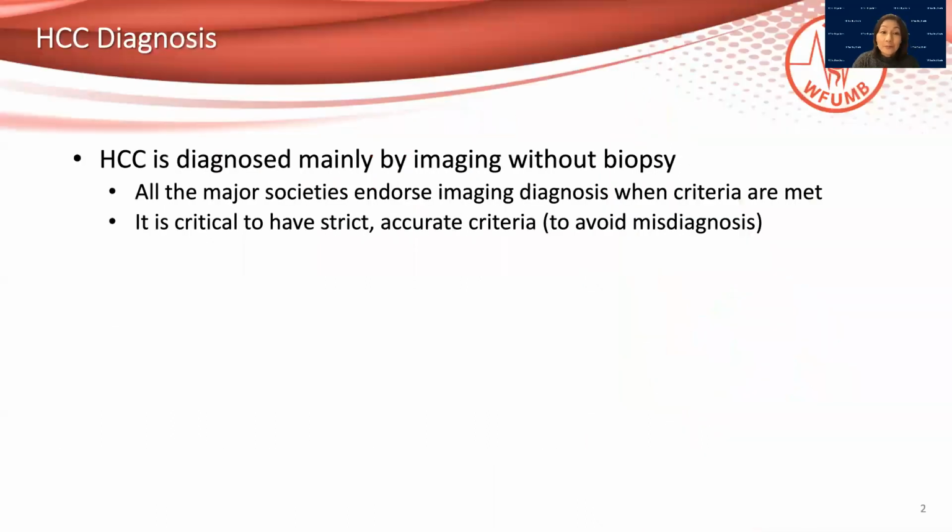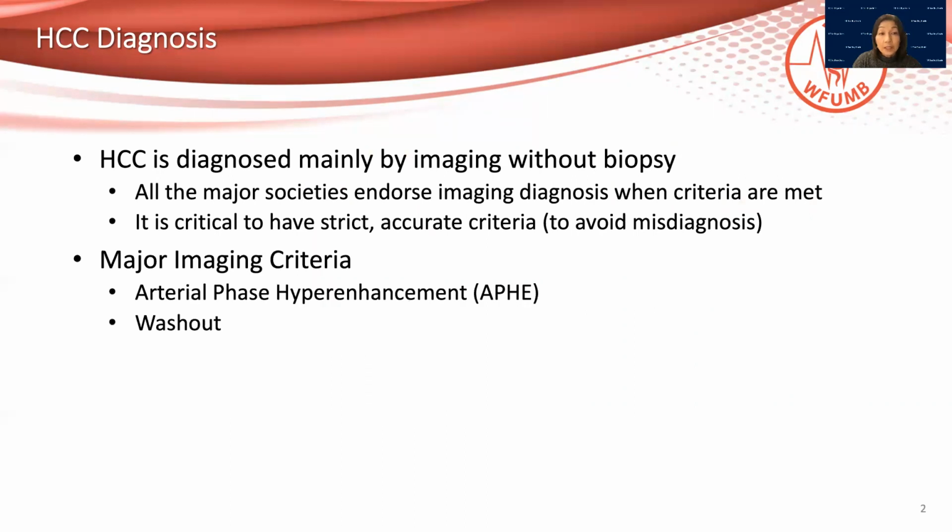HCC is diagnosed mainly by imaging without biopsy, unlike other cancers. All the major societies endorse imaging diagnosis when criteria are met. Therefore, it is critical to have strict and accurate criteria to avoid misdiagnosis. Major imaging criteria include arterial phase hyperenhancement, or APHE, and washout.